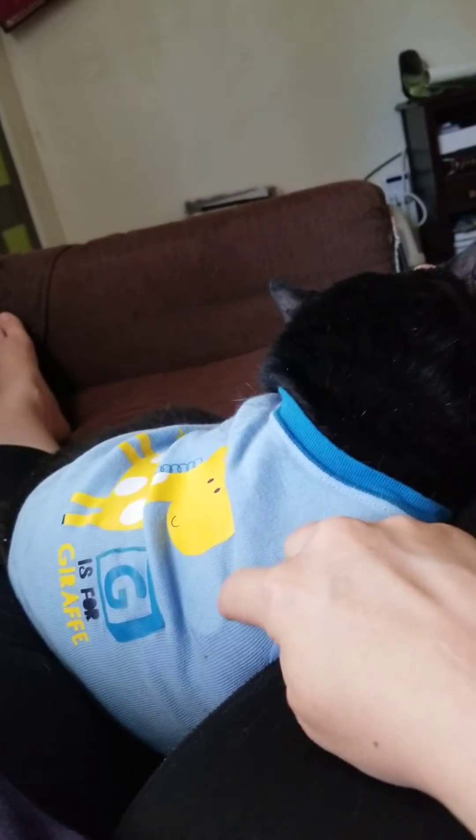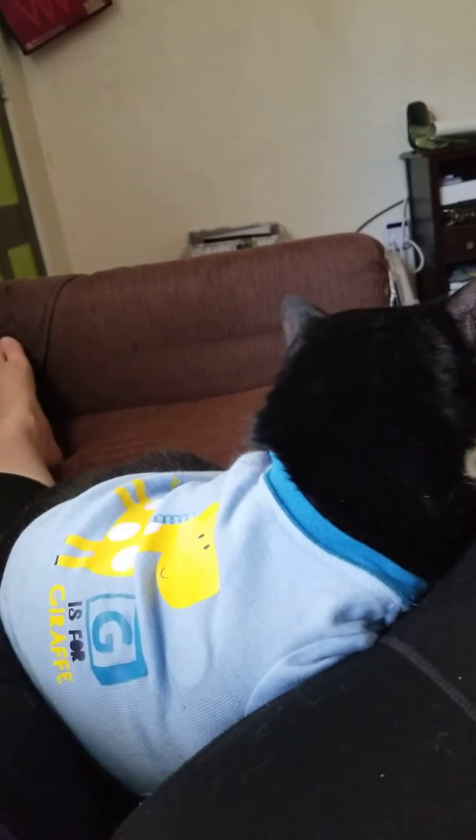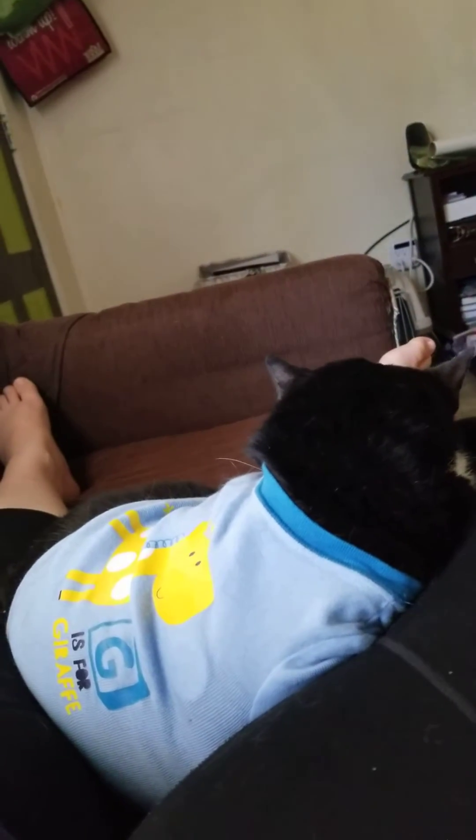It's right here — you can kind of see the outline of it in his shirt that he's wearing. He's just wearing the shirt to keep the sensor in place. He's only had it on for about two hours now, so he's not used to it yet.